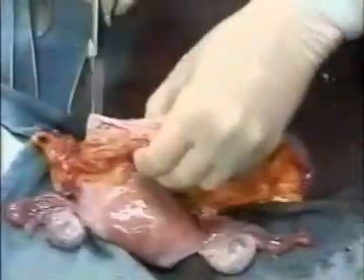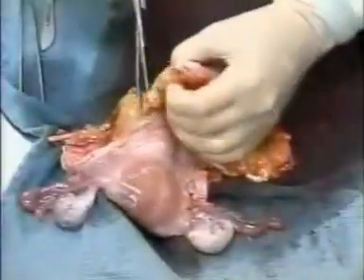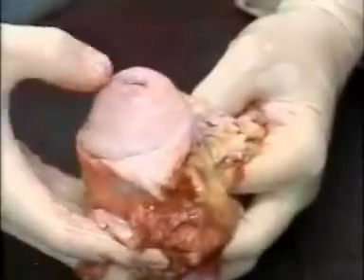Dr. Fricke is now dissecting off the bladder and opening the vagina so that she can see the cervix. This is a cervix that has a slit-like opening, which would indicate that this person has probably had at least one child.